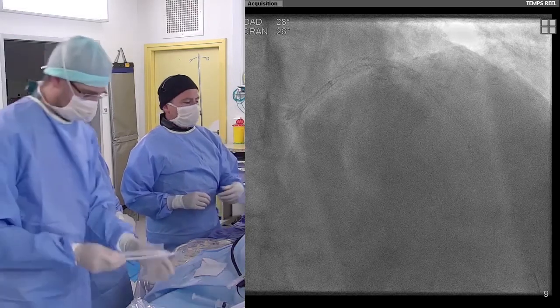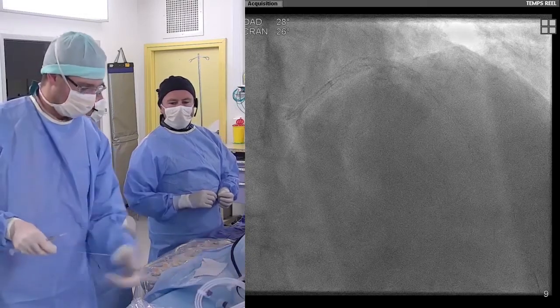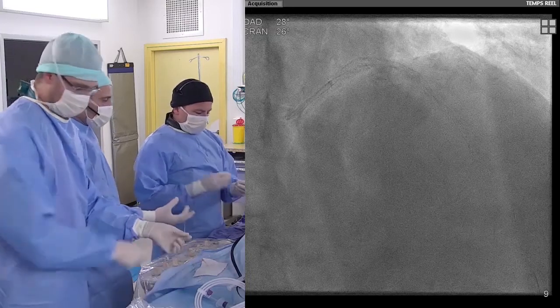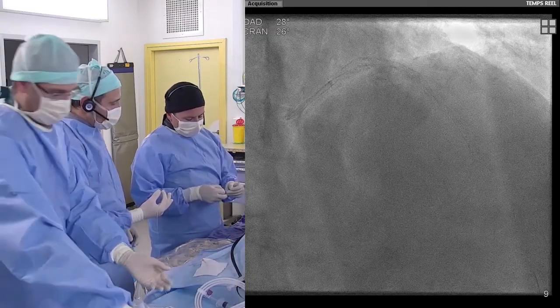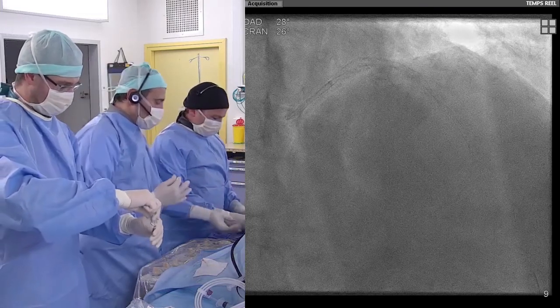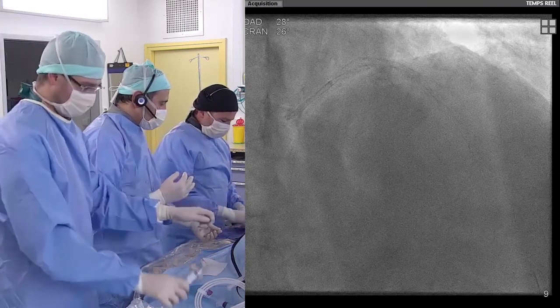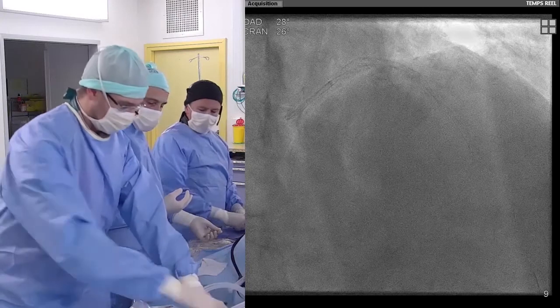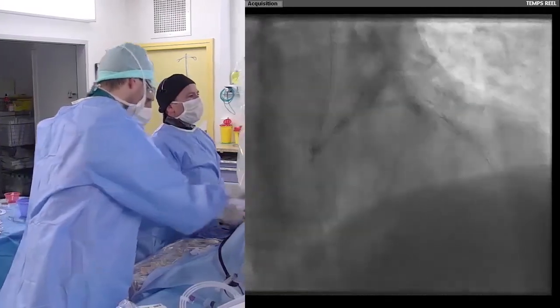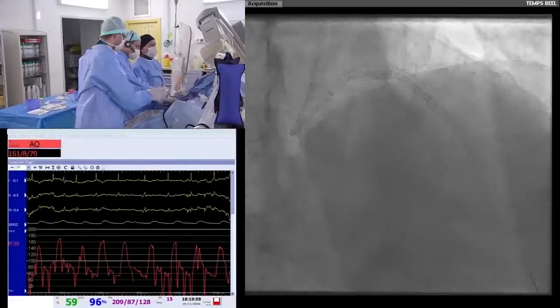Yeah. It's very uncommon. Only for patients with flow impairment during the procedure, thrombotic STEMI, a lot of thrombus, and in case of inability to inhibit platelets, if we fear that the new antiplatelet therapy won't work, we will use parenteral anti-GP2B3A. I think, Didier, you were busy studying this aspect, right?